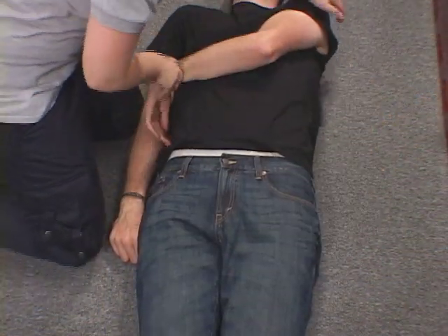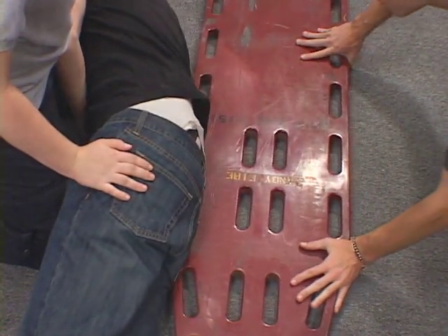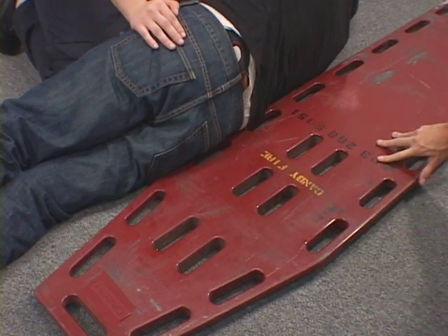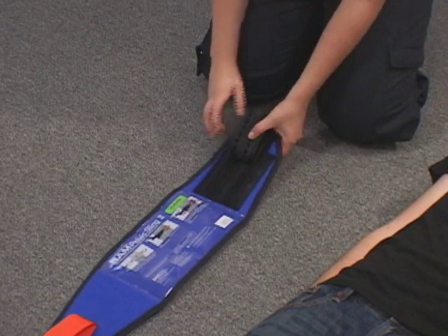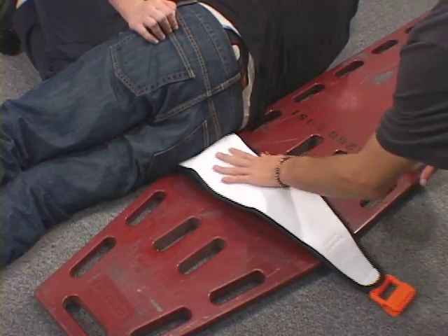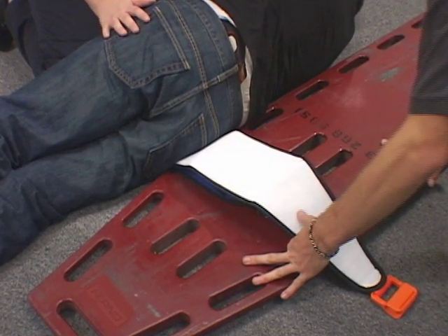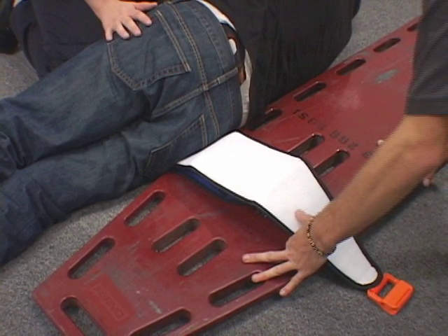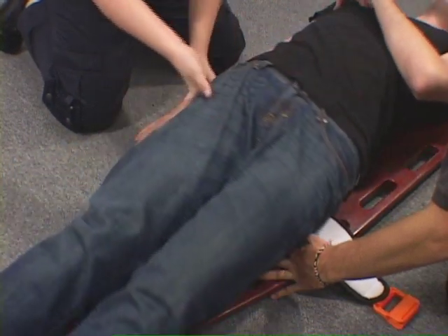If not lying on one side, gently log-roll the patient onto the least affected side. Place the backboard with the distal end at the level of the patient's knees. Create an accordion fold in the end of the sling opposite the buckle side. Place the sling with the accordion fold on the backboard at the estimated trochanteric level. With the backboard pressed tightly against the patient, gently roll the patient onto the backboard and pelvic sling.